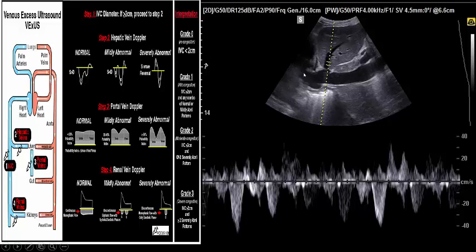The blood will be reflected back, will go back here in the hepatic vein towards my probe, and will give this small wave. But for simplicity, if you see any two positive waves here beside each other, that means systolic reversal. So our patient has one severe abnormality here, systolic reversal in hepatic venous flow.